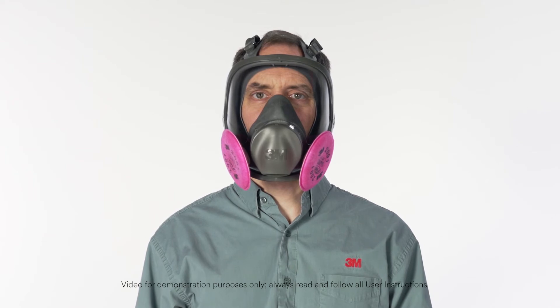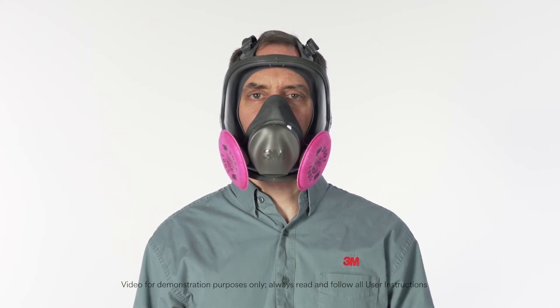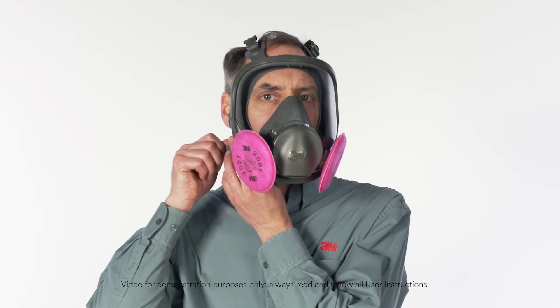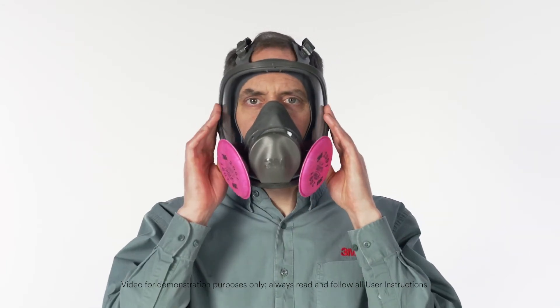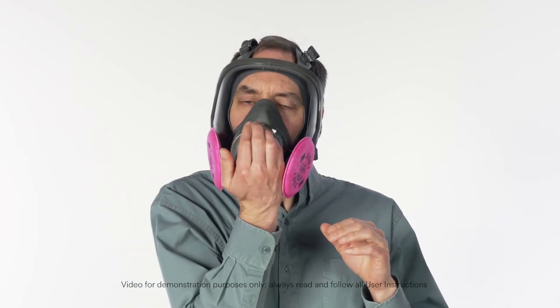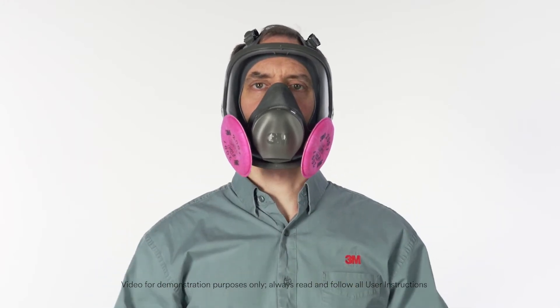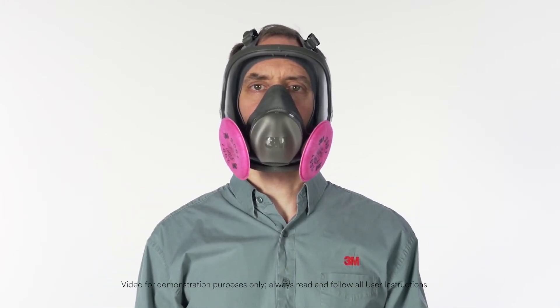A user seal check must be performed every time you put on your respirator. If you detect air leakage when conducting either the positive or negative pressure user seal checks, reposition the respirator on your face or readjust the tension of the straps, then repeat the user seal checks. If you have any difficulty getting the respirator to fit, review the facepiece user instructions or see your supervisor. Never enter a contaminated area if your respirator does not seal properly.